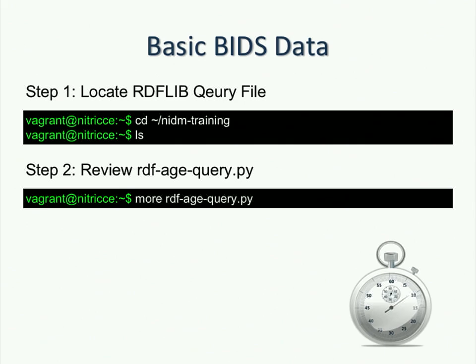But there is a BIDS to NIDM conversion within PyNIDM that does an automatic conversion from a BIDS data set into NIDM. And again, a lot of these tools are open source and being developed and worked on. So these are community developed tools.